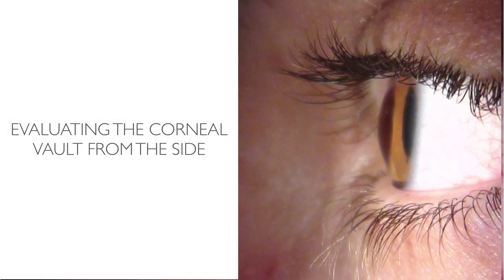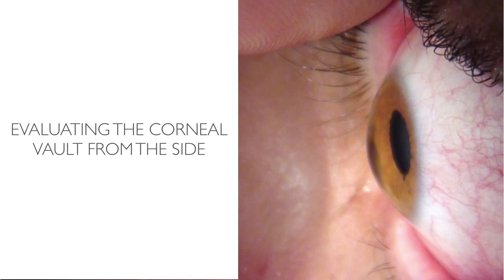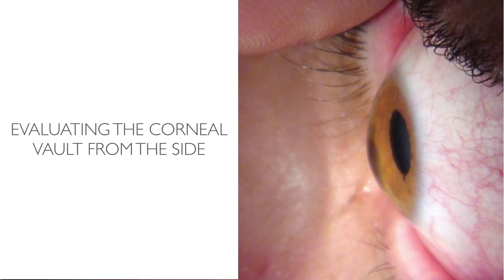Let's evaluate this patient. If we look at that cornea, it is not protruding greatly — I would say that's a fairly low sag design lens — but I need to see where the lens rests on the sclera. So we retract the eyelids and get a better appreciation of where that lens is going to settle. This patient's sclera is not flat; it's fairly steep. So instead of going to the low end of the set, I would go to the medium or middle zone.